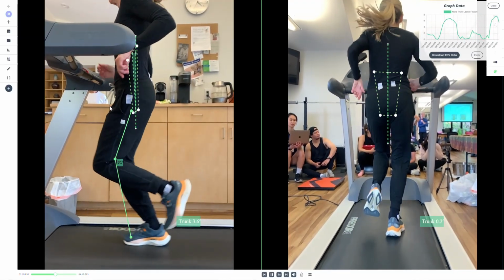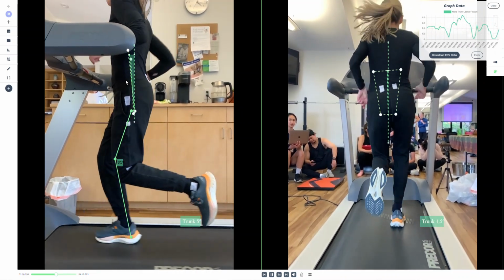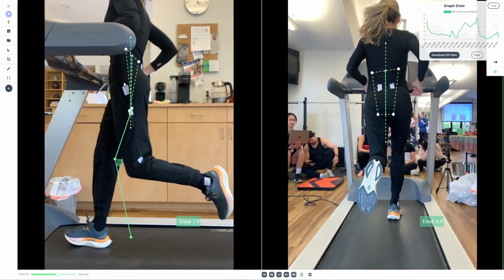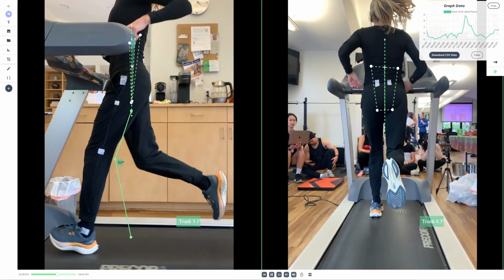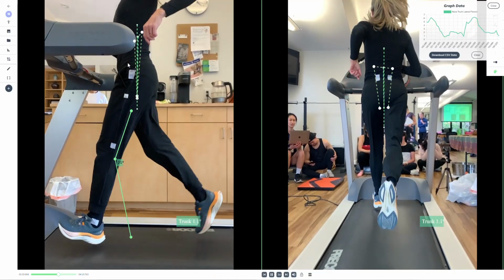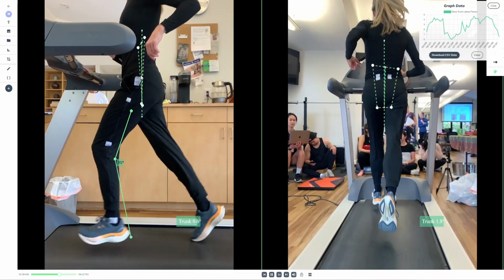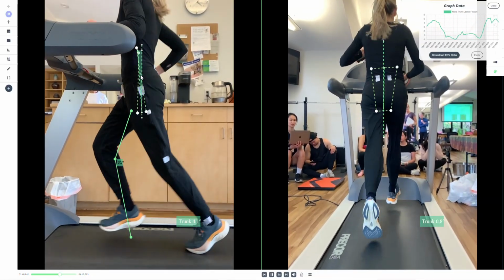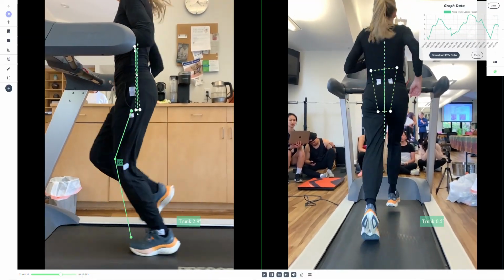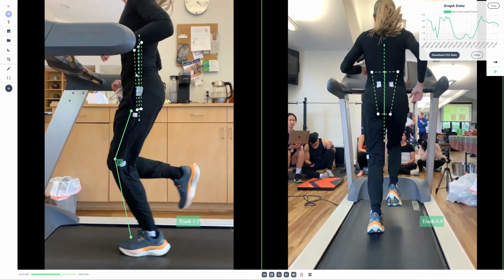The other way that you can grossly appreciate this in the film is looking at the amount of drop, maybe that's the incorrect word, the amount of vertical oscillation of the pelvis on the right leg versus the left, where the pelvis just doesn't drop as much and doesn't fall down. In this case, it would be advantageous for that to happen because it would suggest that there's more springiness in that right limb versus the left.